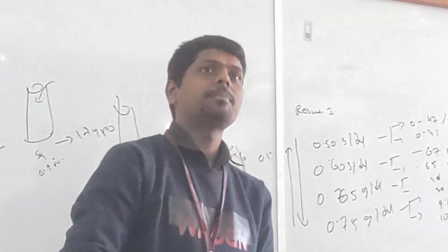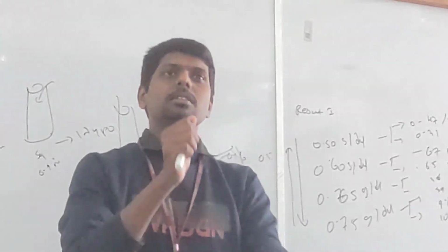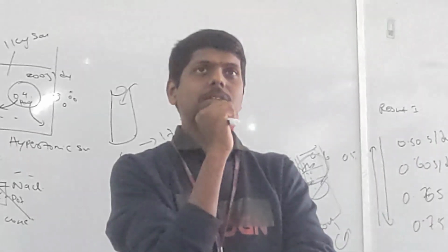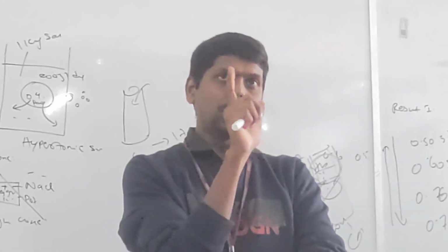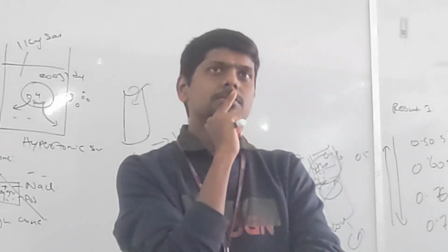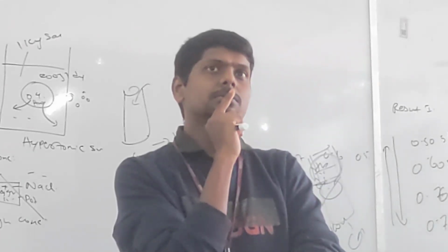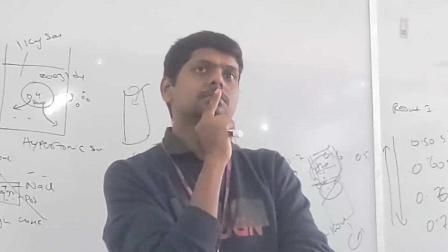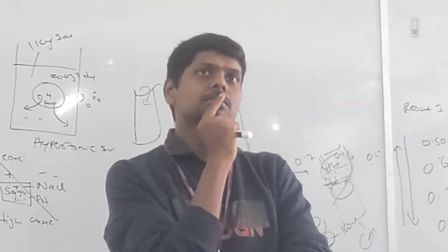Yes, Mr. Aman. A good cell can withstand hypotonic solution, but not an abnormal one. But sir, what if we put a body in such a condition where a normal RBC can withstand and an abnormal cannot?